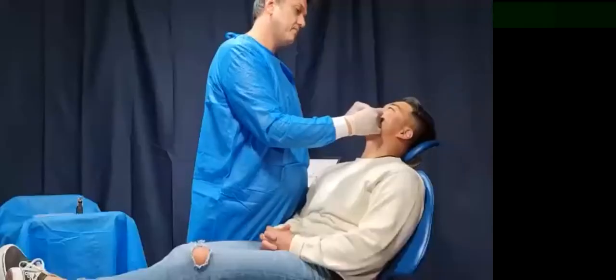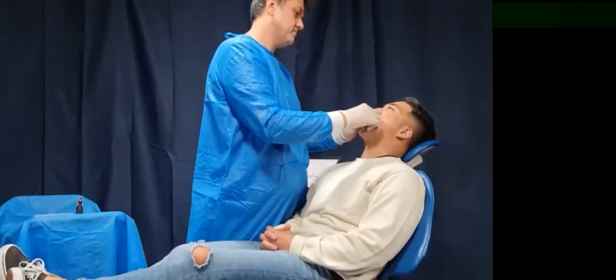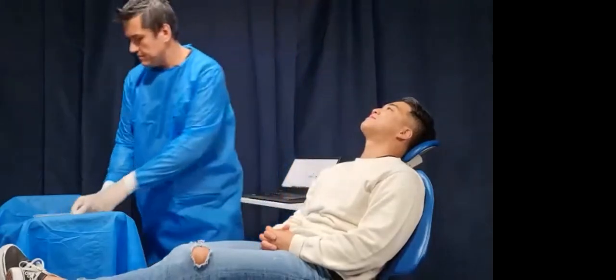The other thing I'm doing now is you can see the wax is covering the buccal surfaces of the teeth. So I'm just peeling with my fingernail, just peeling off some of the wax so that I can expose the buccal aspects of the teeth. Thank you. Open. I'll just pop that back down there for a second.